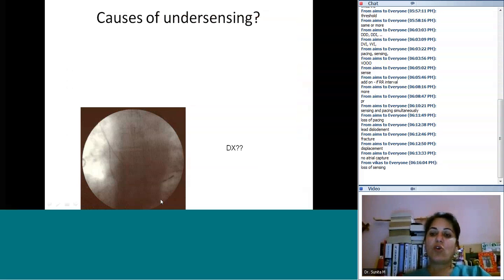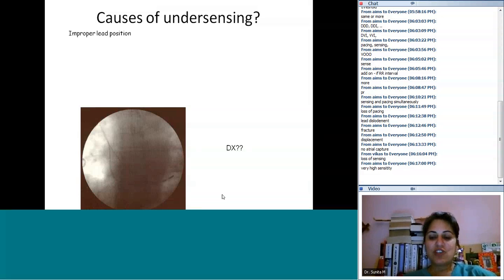Okay? So what are the causes of undersensing? When we talked about causes of loss of capture, what are the causes of undersensing when the pacemaker doesn't sense? Couple of causes. Okay, so I think this chapter everyone needs to read. One, it could be, yes, it could be that the sensitivity is very high, and the pacemaker setting is, you've not set it right. Say sensitivity is 3 and you've set it at 6. So you program the lead sensitivity too high.